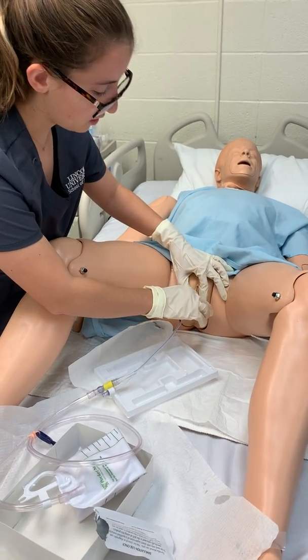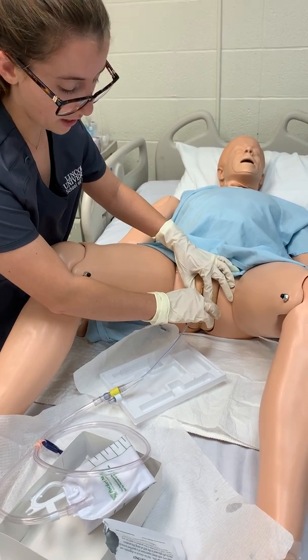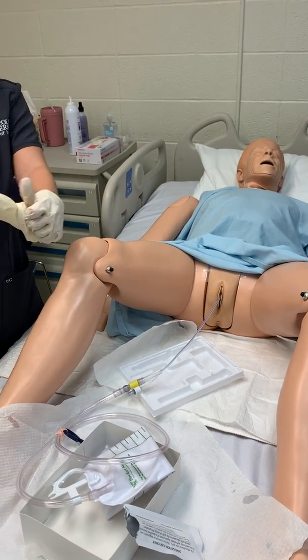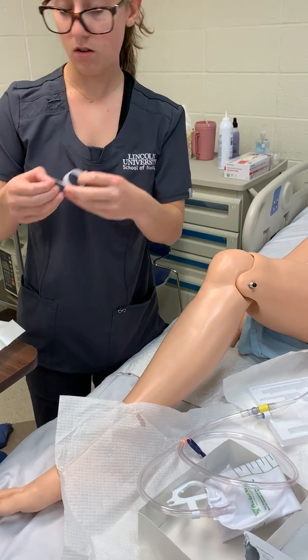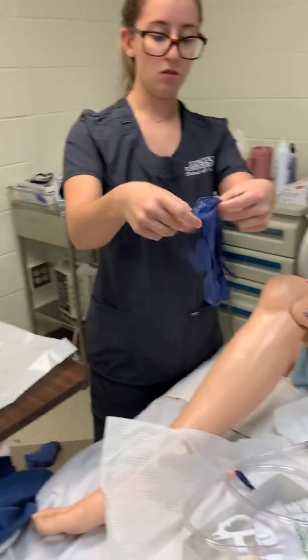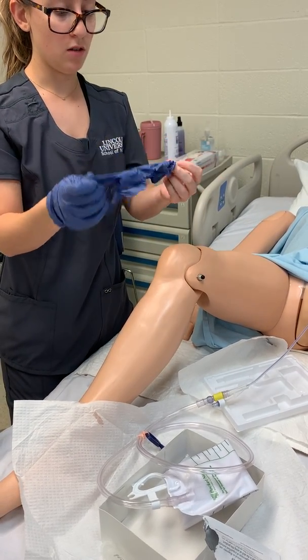So now that I'm done with that, I'm going to go ahead and just give a little tug on my catheter to make sure it's in place. Take off my gloves and attach. I'll apply clean gloves for this. And I'll secure my catheter to her leg, making sure that she still has enough room to move around so it's not too tight on her leg.